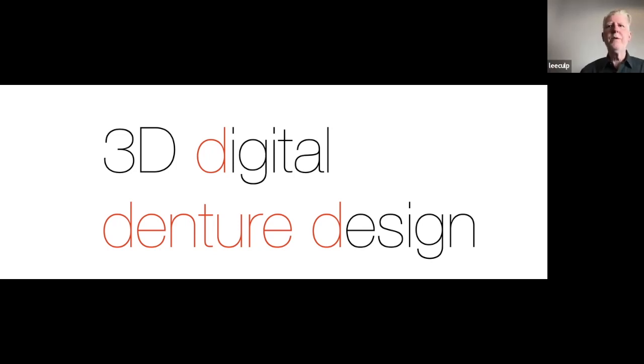Got it. So the bonding, we use Ivoclar bonding materials. So there's a chemical we put on the PMMA that's called Connect. It's also from Ivoclar. Connect is a chemical that allows light cured resins to bond to PMMA. Then we use Monobond and everything else to prepare the metal. And then there's a couple of cements basically designed along the Multilink line. So there's Multilink, which you use in the mouth, which I also use to bond things together.